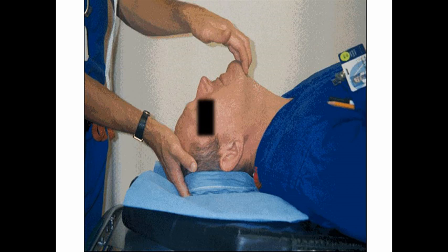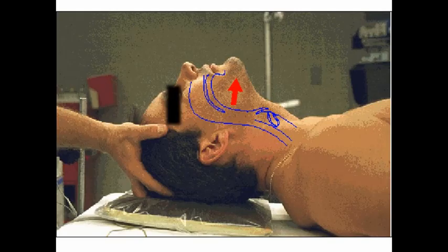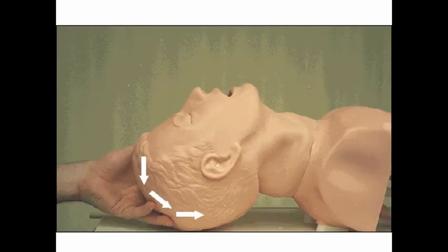This maneuver generates extension at the atlanto-occipital joint between the base of the skull and the cervical vertebrae, so that the head is extended on a slightly flexed neck. Traditionally, anesthesia providers have described this important position as the sniffing the morning air position.